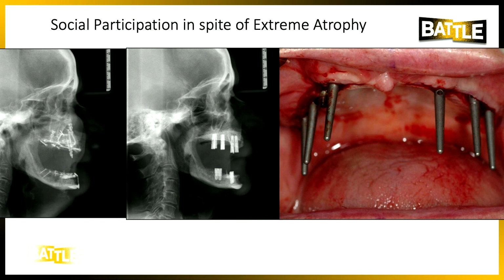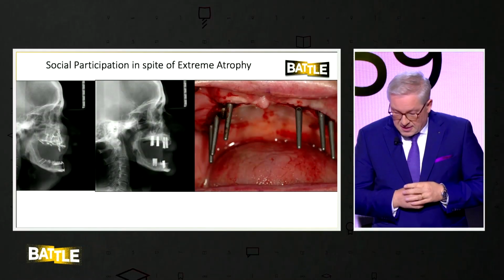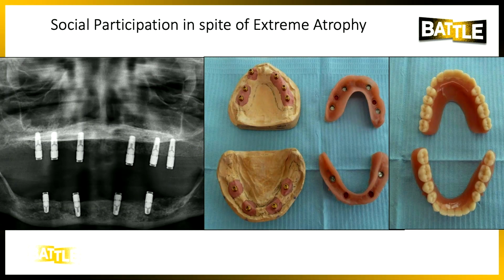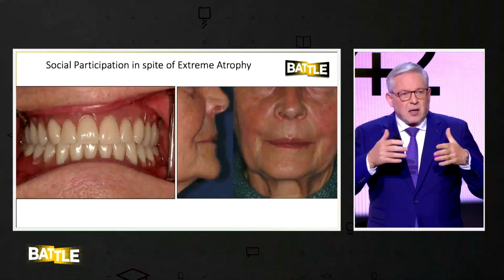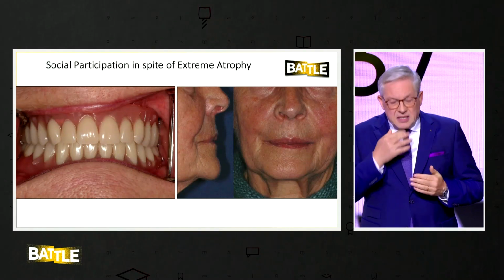And look upon these cephalograms, how much bone was gained vertically. The maxilla was also moved a little bit forward, and this allows us to place the implants parallel, and this enables an easy prosthetic workflow, and no cantilevered prostheses are necessary. This over 70-year-old patient, she stayed with her overdenture concept, locators were used. And look upon this lower face, the lips are prominent, the modioli are staying upwards, and there's no sagging chin.